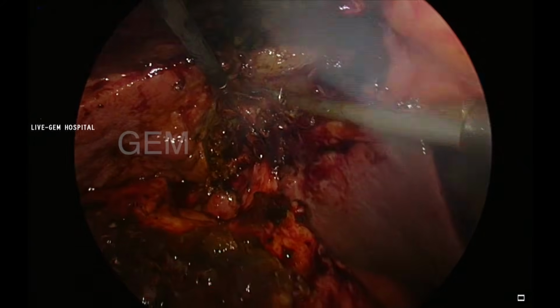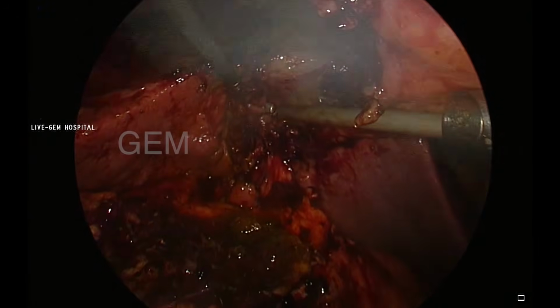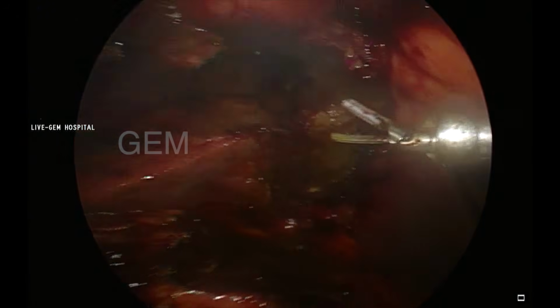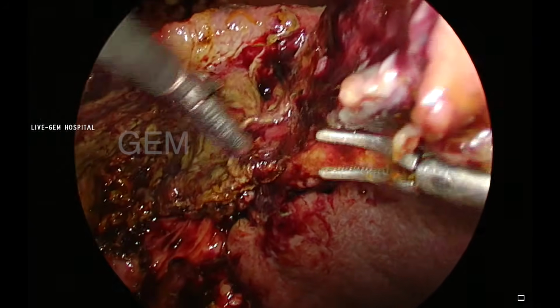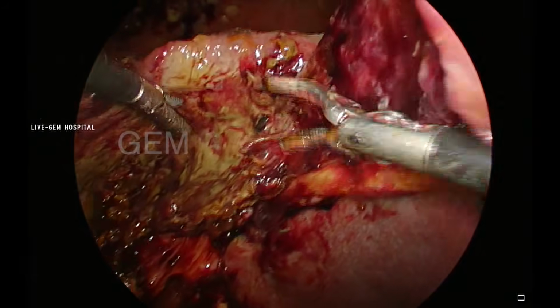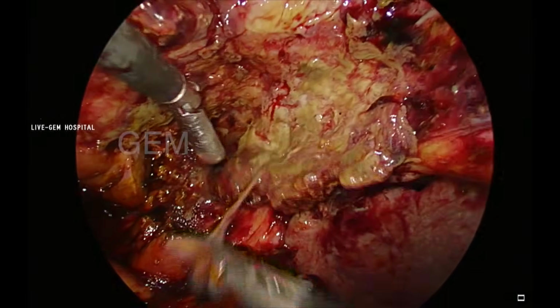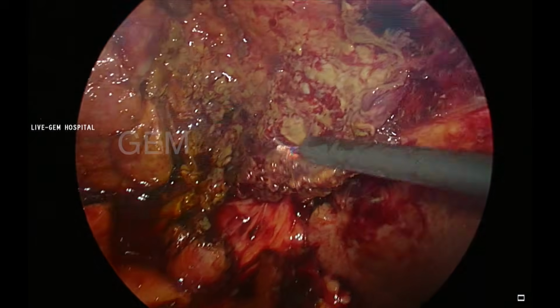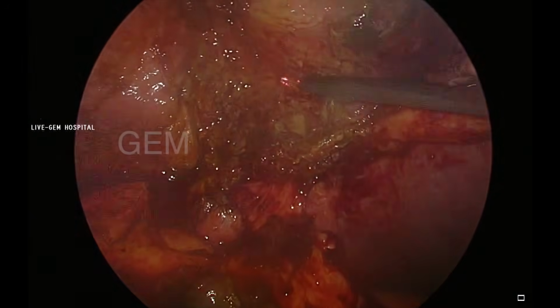Now the remaining part of the gallbladder I am excising. The anterior wall and posterior wall of the gallbladder are left behind on the liver. So it is type 1 and type 2 combined, and it is called a type 3 modification. All this gangrenous material, the mucosa of the gallbladder, is removed. Some portions you can coagulate like this if they are very densely adherent.